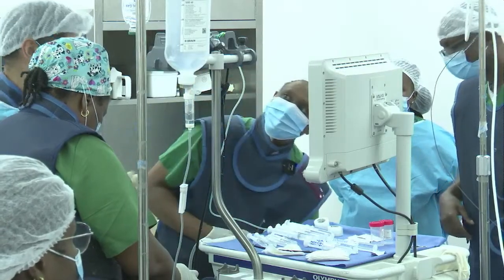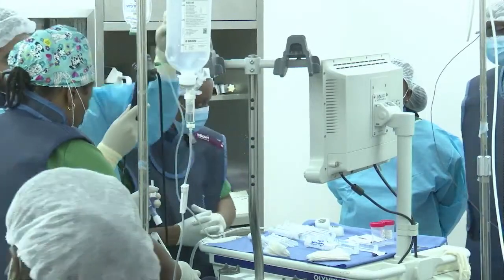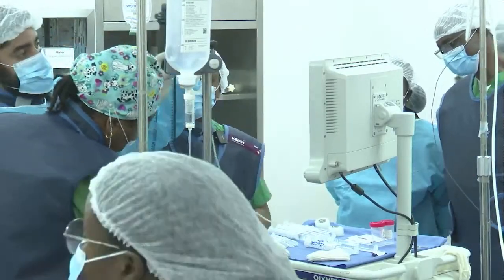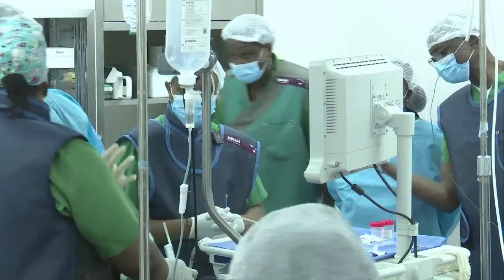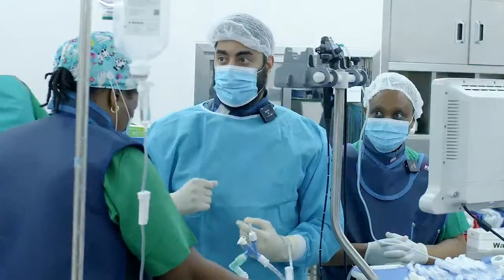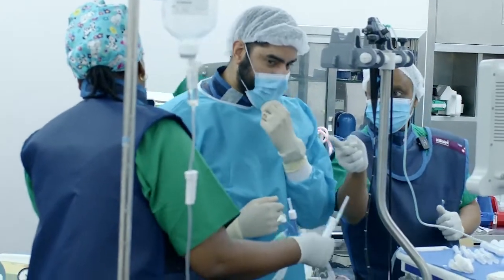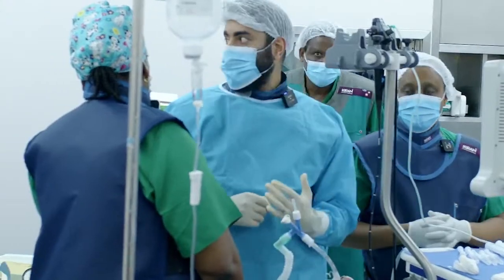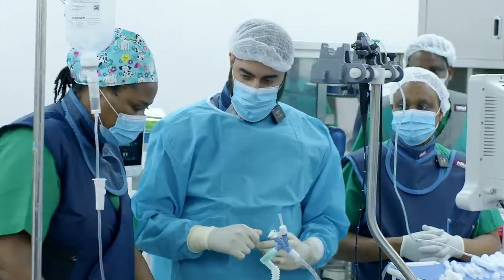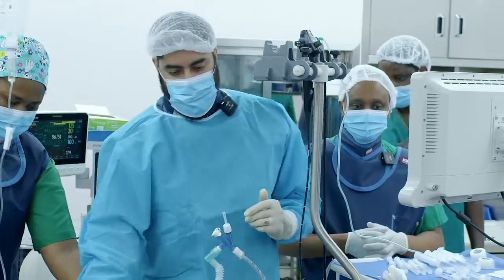Okay, sure. I can start. Suction and fluoroscopy. I need the CM. Let's get the CM on before we start, please. That way it's straight. Yeah, Sheila, if you're set, we can bring the CM in now. Drip stand. Yeah, that's fine. Let's get this drip stand out of the way.